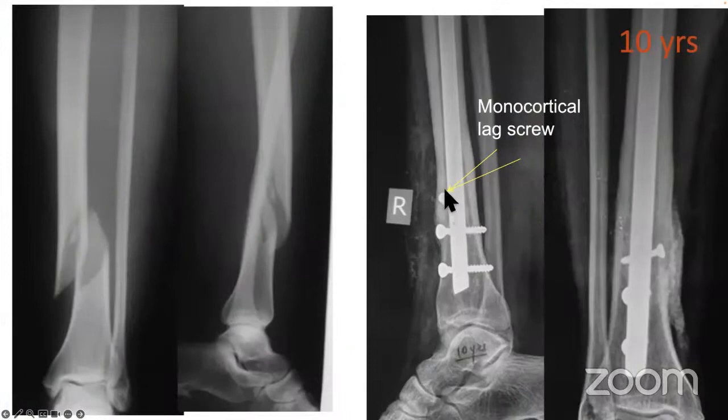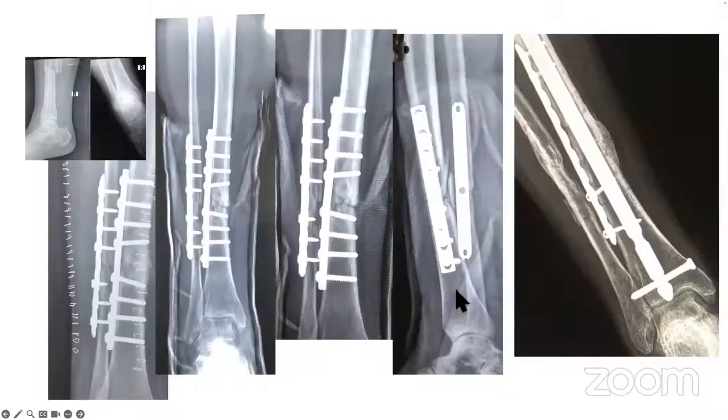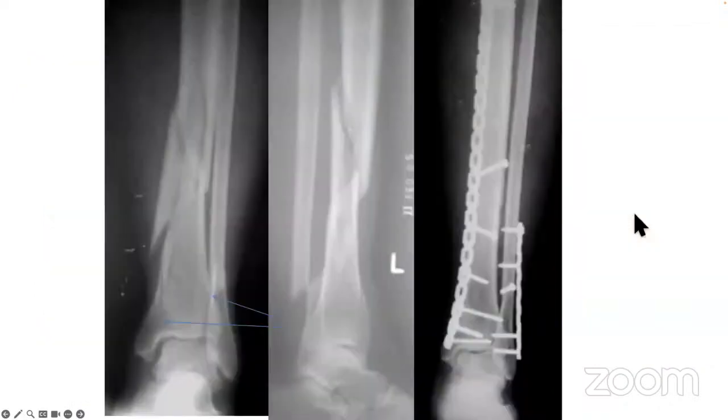In the past, or still occasionally, I put in this lag screw in these short oblique fractures. Put in this lag screw into the one cortex, and then do a nail. These are very old x-rays. Now, all of them, you put in this nail and a plate. This is notorious for a non-union, because, again, this is a junctional fracture. So the treatment is a nail and a plate.